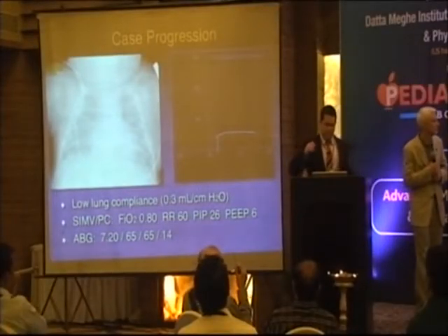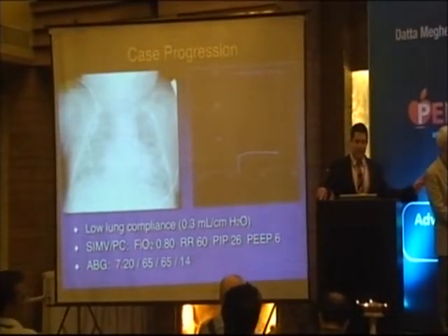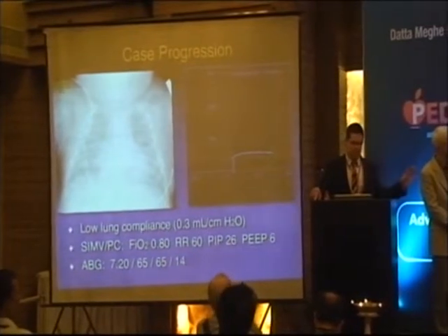Great. In this particular patient, we're using pressure control ventilation, using a high pressure, not getting much volume. We know that this patient has low lung compliance. If we measure the lung compliance dynamically on the mechanical ventilator, it reads 0.3 mLs per centimeter of water pressure. Typically, your compliance should be 1 ml per centimeter water pressure per kilogram. So in a newborn baby with RDS, you should be looking at a compliance of about 1, and it's about half of that now. So this baby has some serious issues.